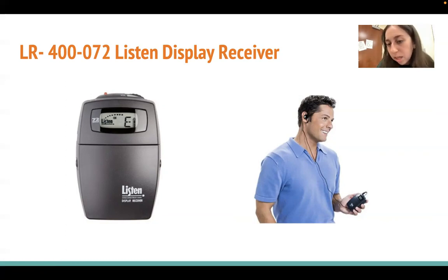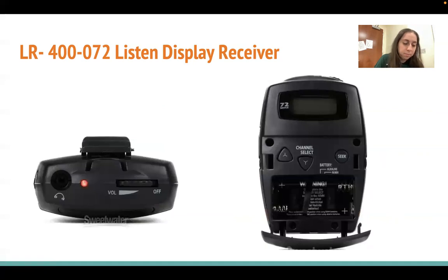But just look at how he looks. He has his device here. It's connected via the broadcast, right? It's transmitting, and it's sending the signal directly to his ears. Okay, so this is just the body of it and what it looks like.